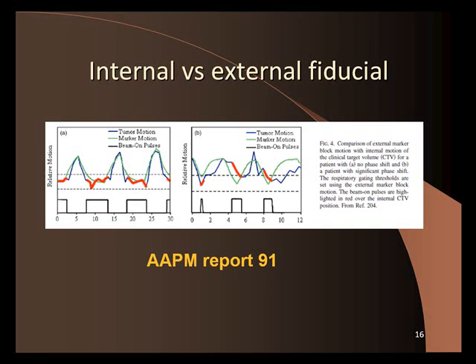And what people do to track the tumor motion is they'll have the patient go to interventional radiology and they'll put a marker, like a metal marker, right in the tumor with a needle. And then they'll x-ray this tumor during treatment. So that way they can track the tumor. And then what this slide shows is a couple of graphs. It shows one patient, and there's another patient.